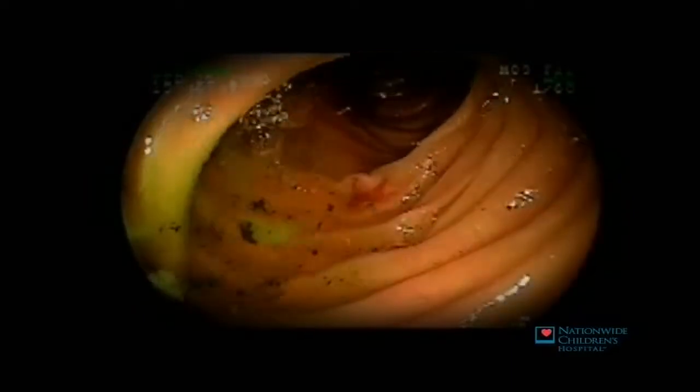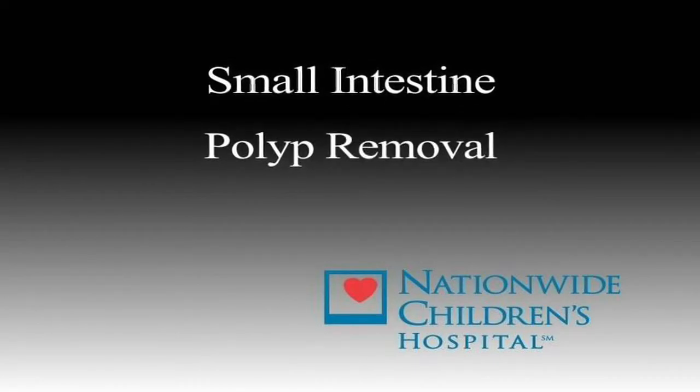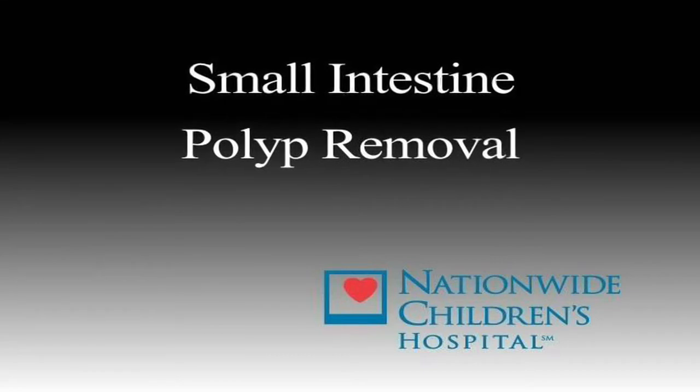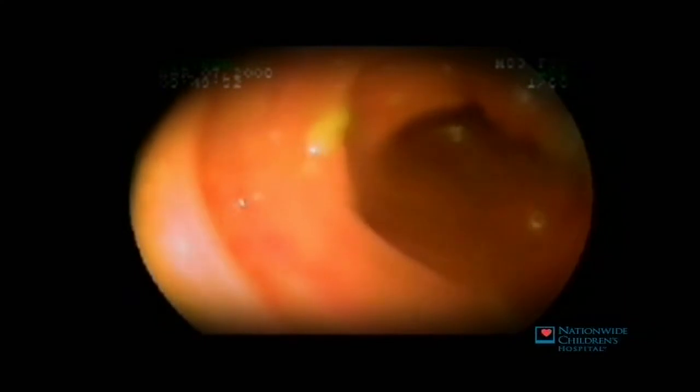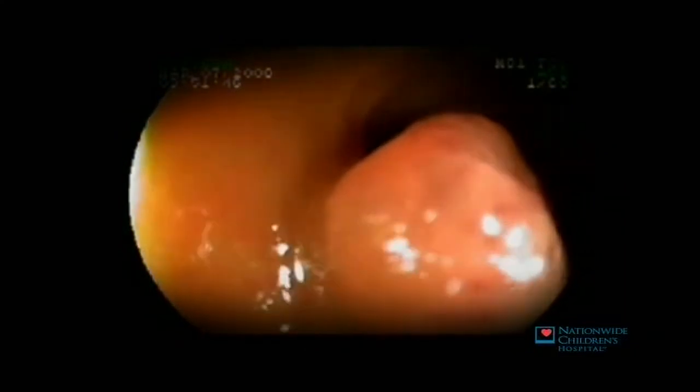Here, a biopsy forcep is used to take a sample of the lining of the small intestine. As you'll see in a moment, we can do other things as well. This is an example of therapeutic double-balloon enteroscopy. The lesion you're about to see is a congenital vascular abnormality that can oftentimes be found in the small intestine, known as a hemangioma.